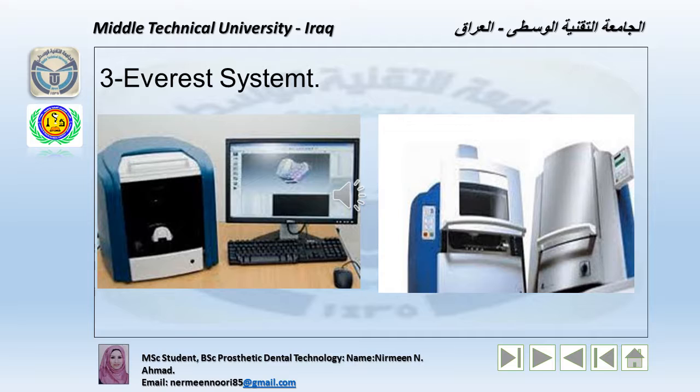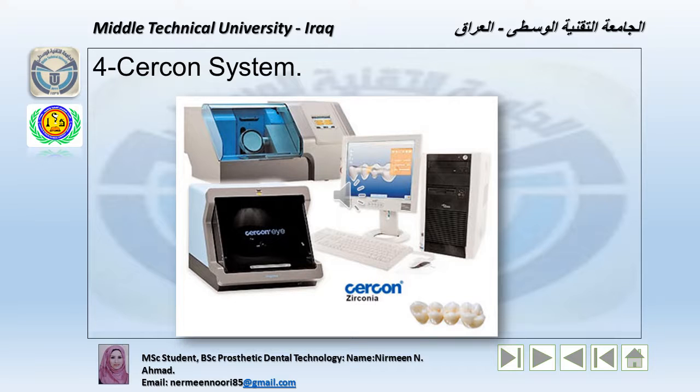Materials include leucite reinforced glass ceramic, partially and fully sintered zirconia, and titanium. The process center is a dental lab, the scanning machine is optical, the CAD program is custom design with a database, and the CAM process is fully automatic.